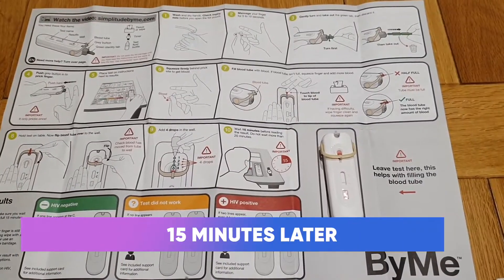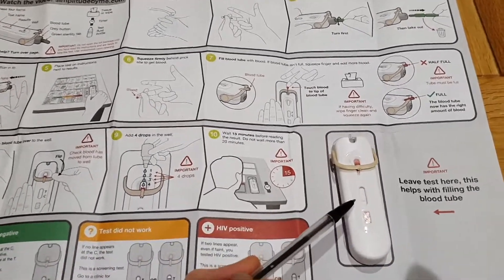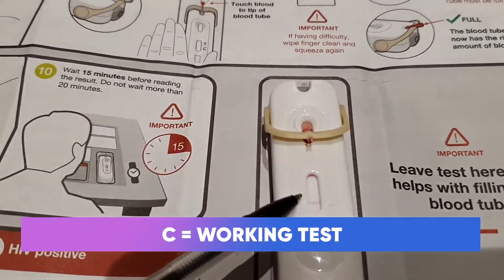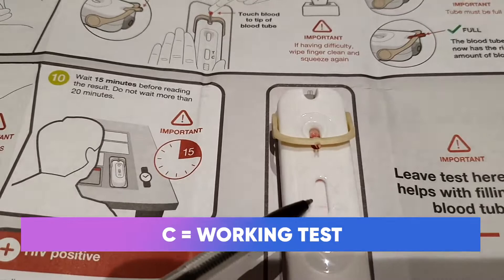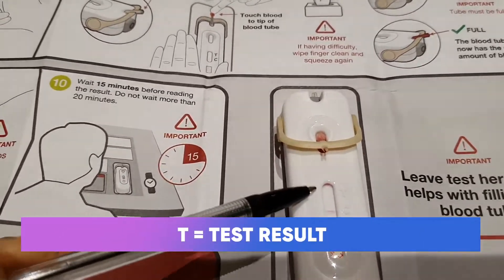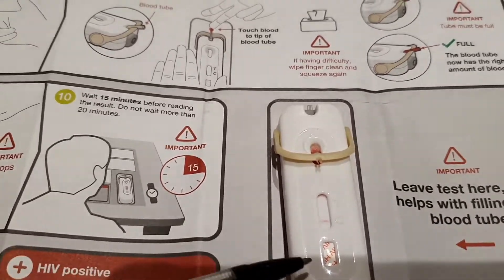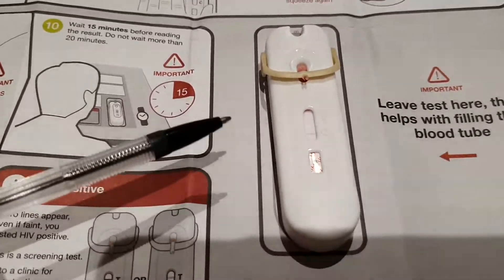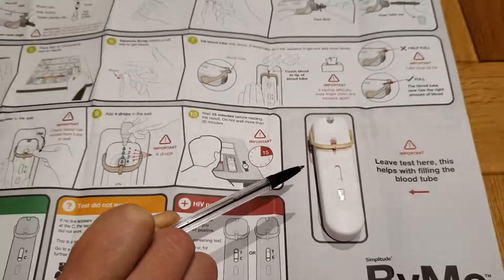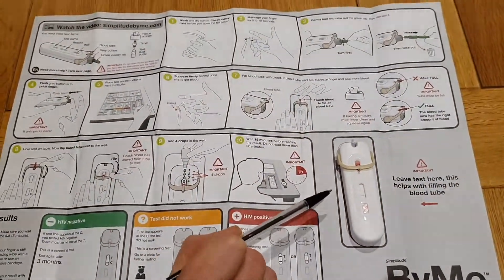The 15 minutes is over and here is my test result. The C line — what's called a control line — is there, and that shows the test has worked. The test result line has no line there, so this is a negative test. If there was a line there, that would be a positive test. Please remember this is a screening test and it doesn't account for the last three months — everything before the three-month window going back in time it accounts for, but not the last three months.